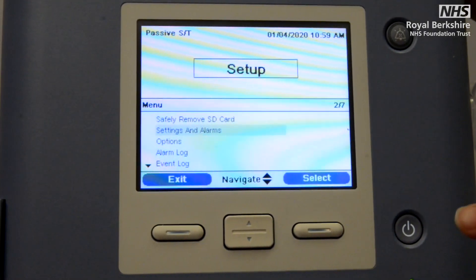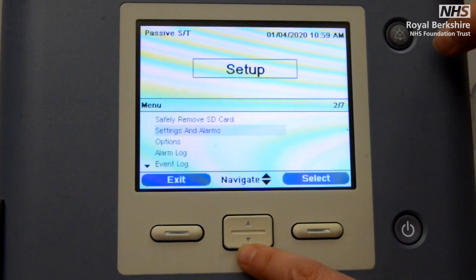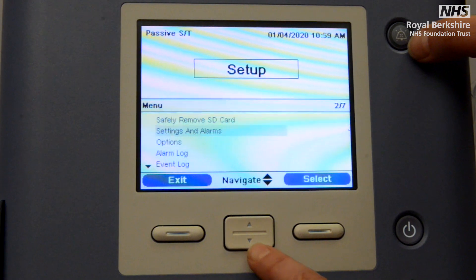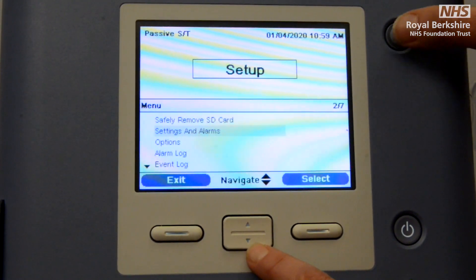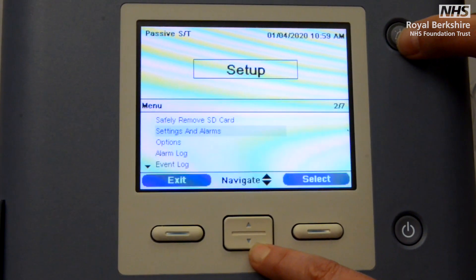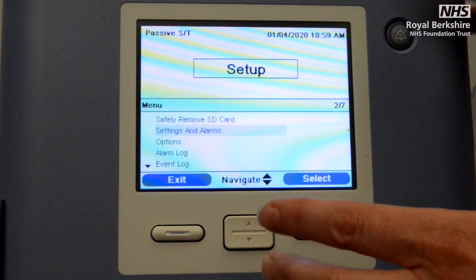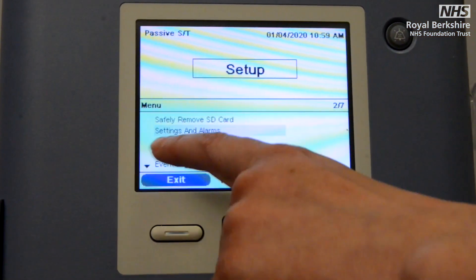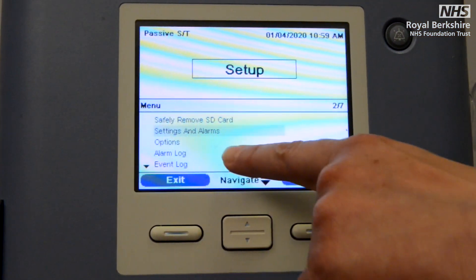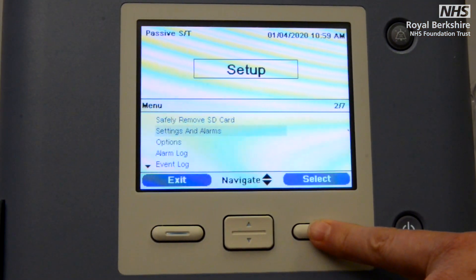We've already entered our setup screen — just to recap, using the down arrow and the alarm silence button at the same time — and that's brought us through to here. We've come to our settings and alarms, and that's where we want to get into.